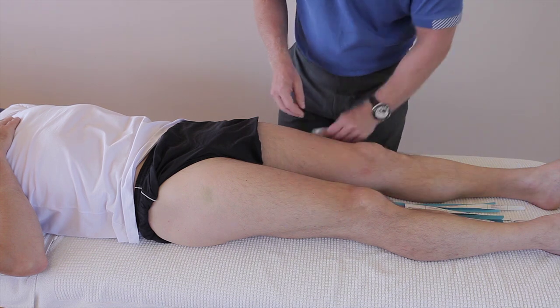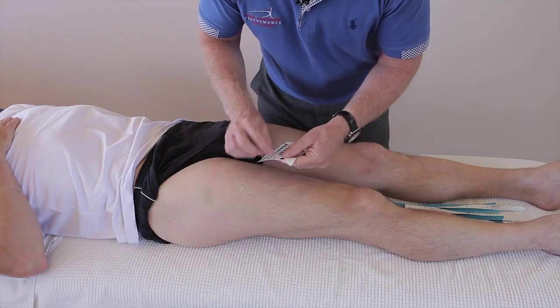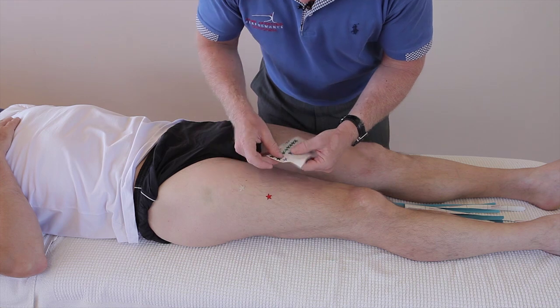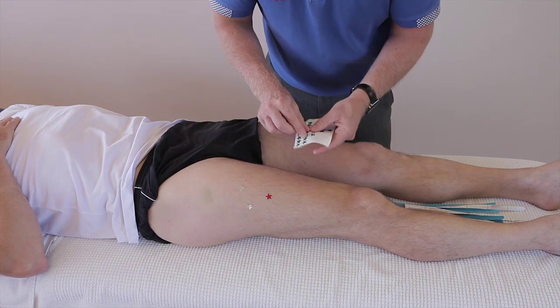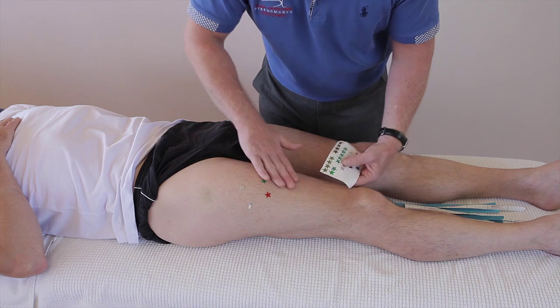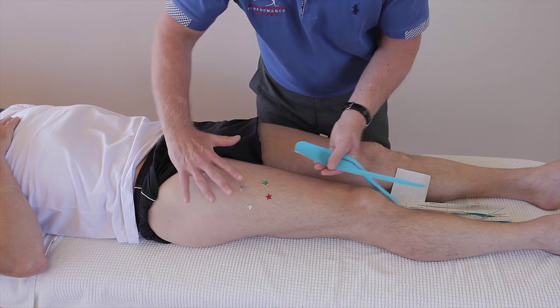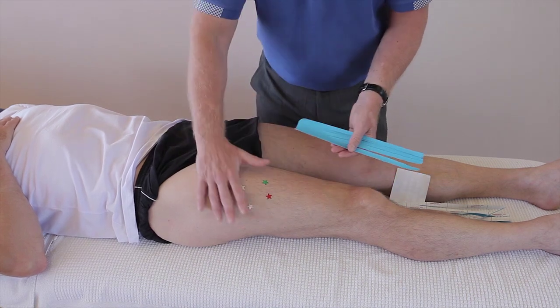I'm just going to mark where the pain and swelling would be — it might be in a few areas. The swelling might be even down to the actual knee. So if we just isolate this area where the pain would be, then we're going to cover that area. The fingers are actually going to cross over the pain.